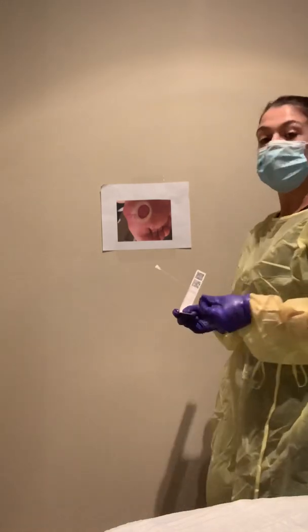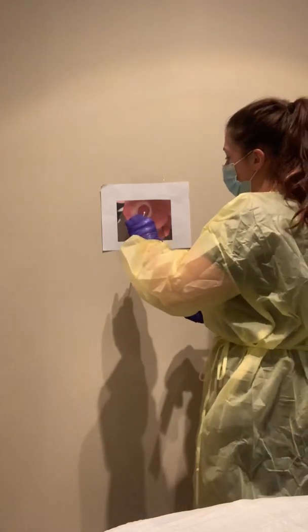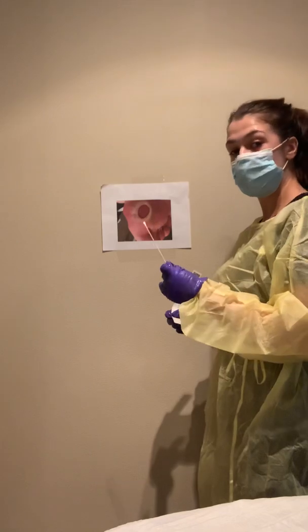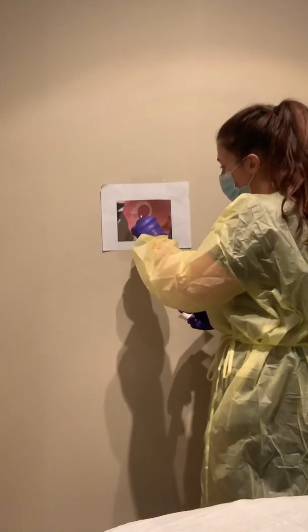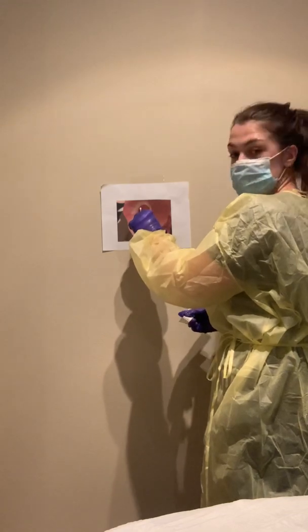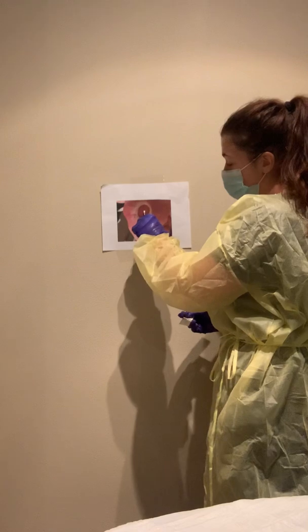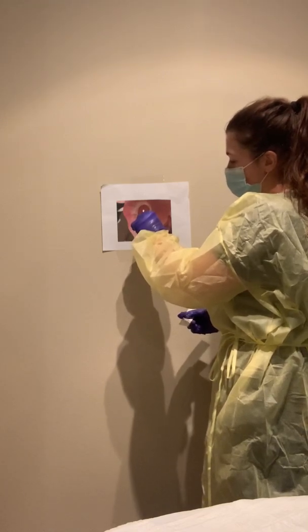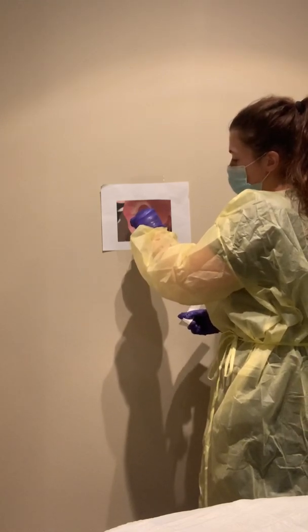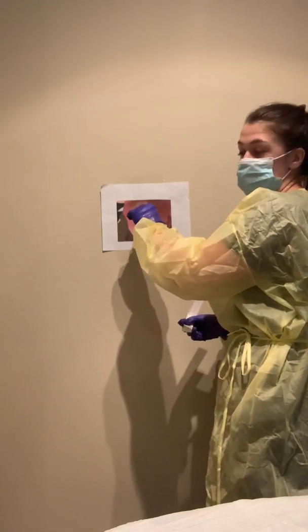So the next thing that we're gonna do is measure our depth of the wound, and to do this, we're gonna first go ahead and just start probing the wound with our cotton tip applicator. And so we're feeling a springy end feel here, which indicates tissue, which is what we would expect for a wound with this presentation. Now to find the depth of the wound, I would go ahead and stop where I see the deepest part of the wound with my cotton tip applicator.